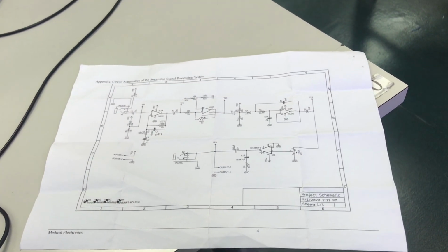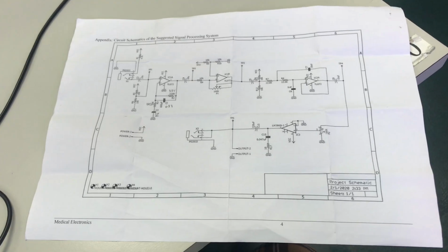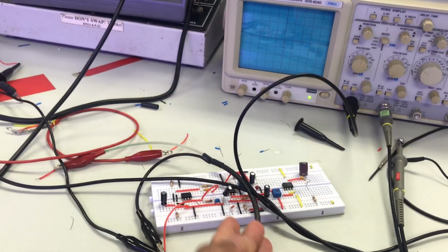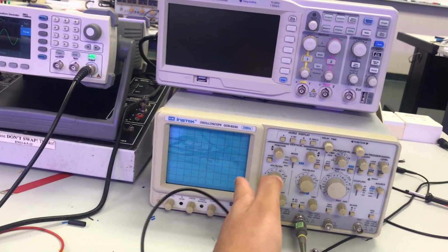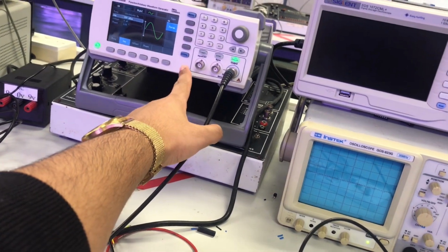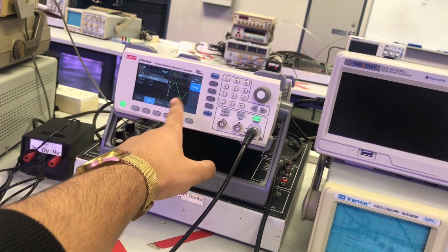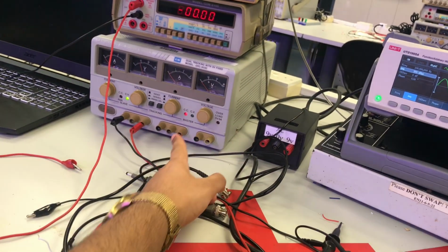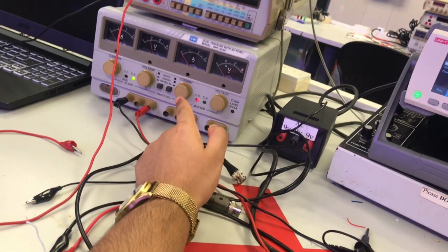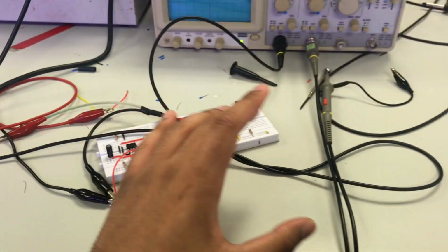So this is the schematic diagram for the project of medical devices. I print this out. So based on this, I'll be patching this circuit, which I've already patched. I'll be using the oscilloscope here to show the frequencies, and to generate the sine wave, I'll be using this function generator at the setting of 100 Hz and 200 millivolt peak to peak, and I'll be getting the power source from here, at 9 volts. I'm planning to use the 9 volts to power up my circuit here.